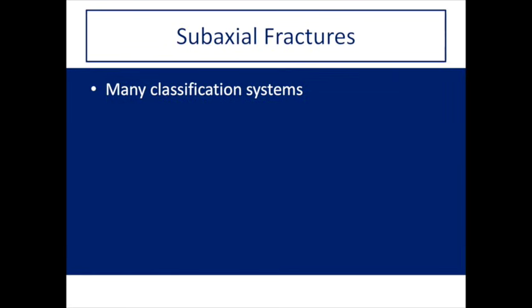I do think it's important to at least be familiar with the various classification systems, terms, and mechanisms, but because there is a lot of overlap in terminology, for example, the most common cause of a chance fracture is a flexion distraction injury, and multiple mechanisms can occur in one injury, I think that relying on these terms to describe injuries can really confuse things.